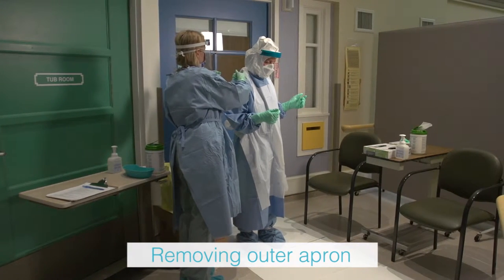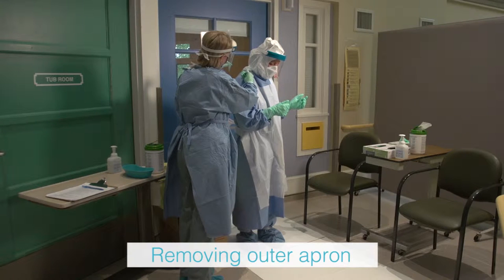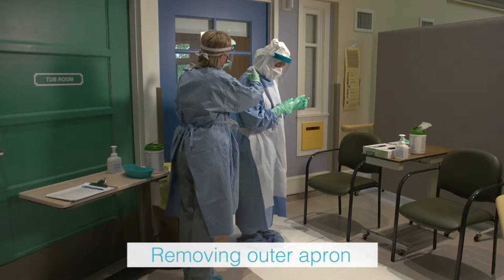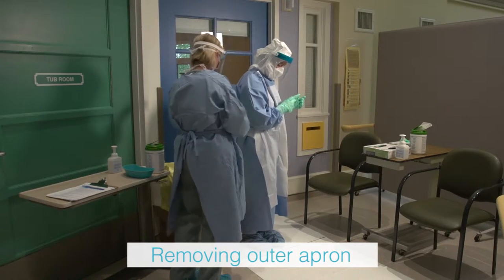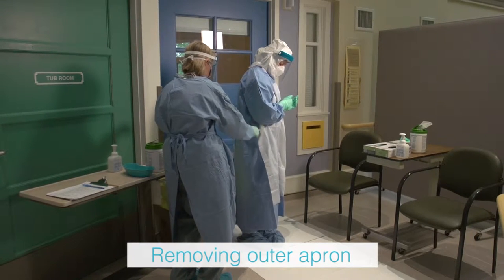If the outer apron was used, the trained observer will assist by cutting the apron at the neck and waist ties with a pair of scissors. The trained observer will then cleanse the scissors with a disinfectant wipe. The health care provider will gently roll the apron onto itself and place it in the waste receptacle.